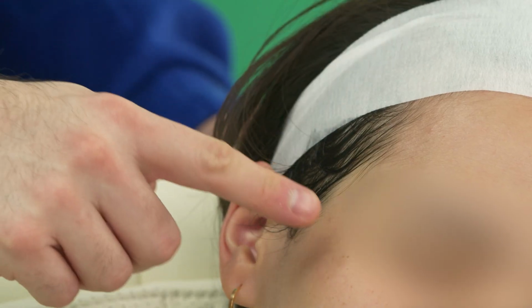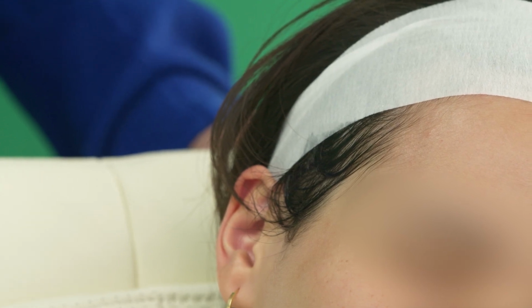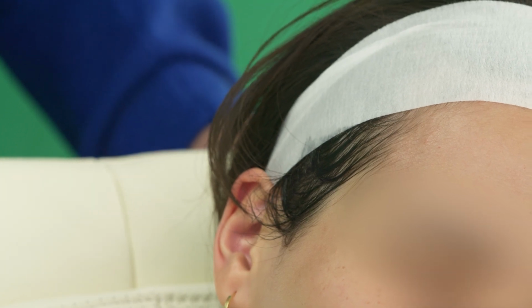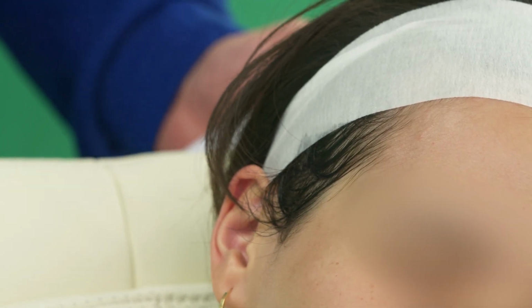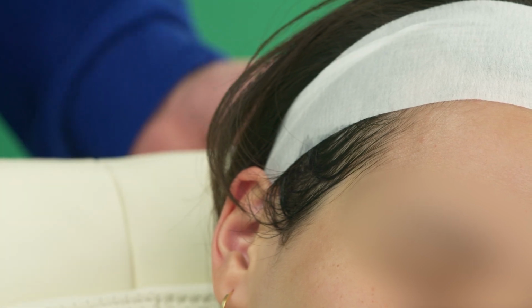At the temple region, several procedures are performed, such as filler injection for correction of the hollow temple or the insertion point for threading lifting. However, there are some anatomical structures that we must consider before starting any of those procedures.